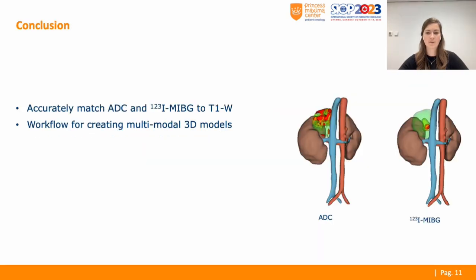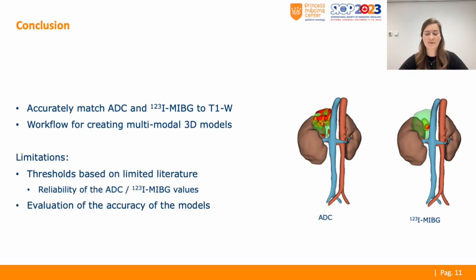So to conclude, we were able to match the ADC and the MIBG images to our T1 weighted models, and we have created a workflow for creating multimodal 3D models. However, there are still some limitations as the thresholds are based on limited literature, which questions the reliability of our ADC and MIBG values that we use, and we should evaluate the accuracy of the models. But we are currently working on this, so hopefully next year we can bring some exciting news.